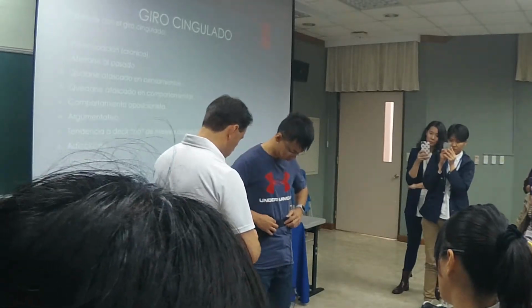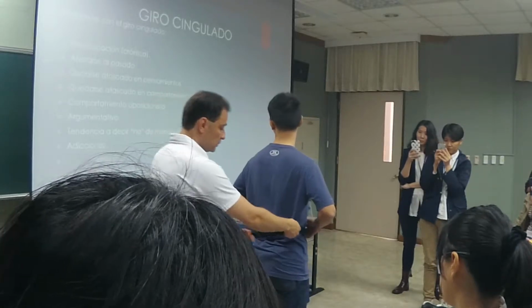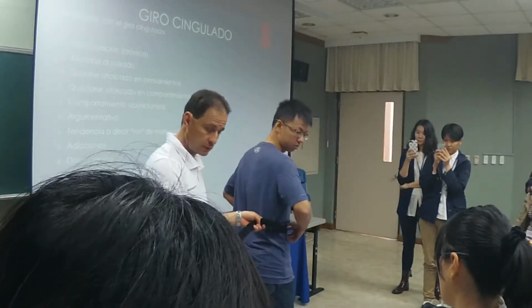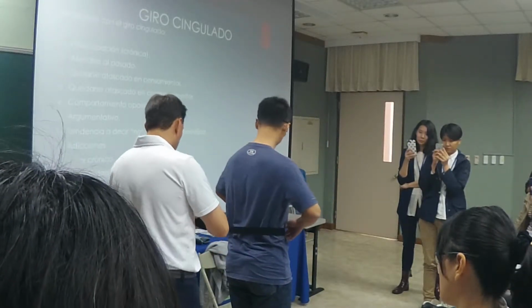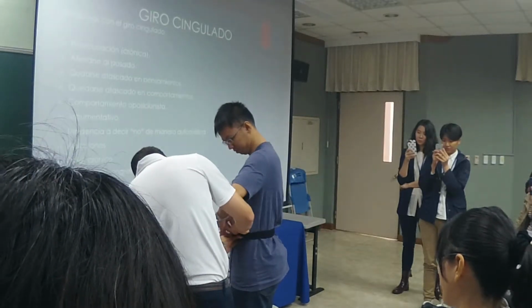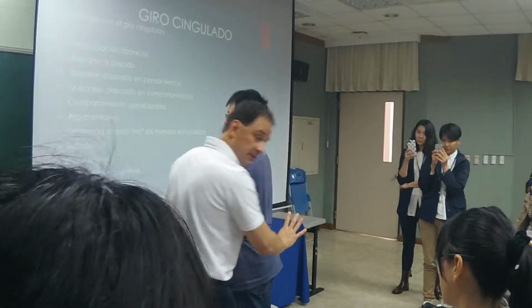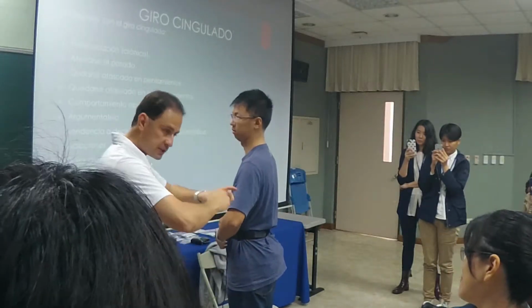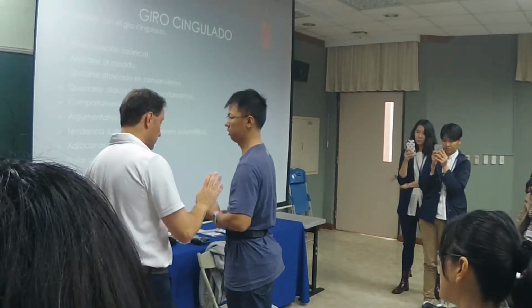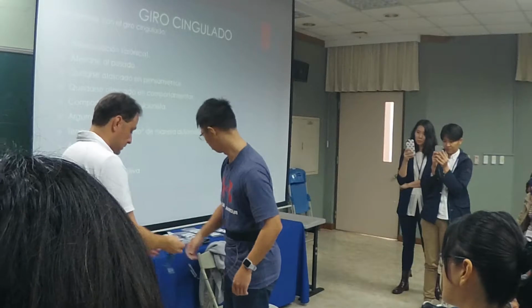And what I'm going to do is open this, and I want you to turn around all the way for me, so that you don't have to come close to the client. Just keep turning for me all the way, please. More. Keep turning, please. There you go. And see? It fits like that. See, the Velcro is nice and snug, so it's not twisted. Is that good for you? Is that nice and snug? Okay. Please hand me the cable. Thank you. And you can go ahead and sit.